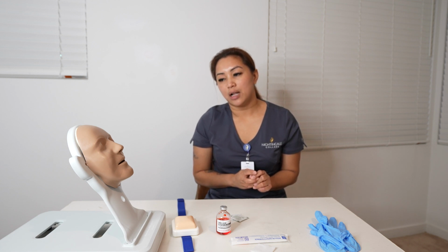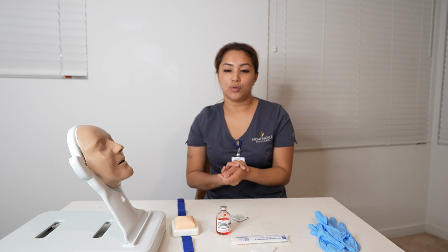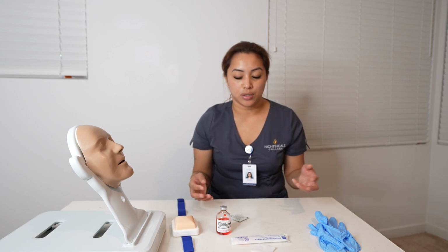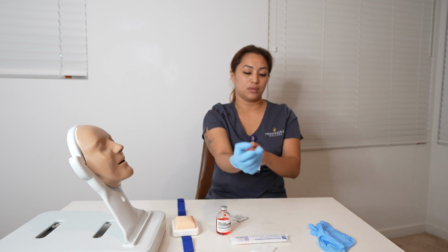Do you have any allergies, Miss Smith? Any medication allergies, food allergies, seasonal allergies? No? Alright, perfect. Do you have any questions for me? No. Alright, so I'm going to wash my hands. Now I'm going to prepare the medication. So I'm going to put on my gloves.